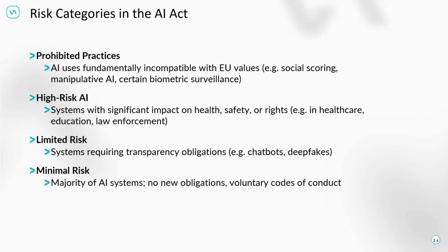That's what the AI shall do. It shall not be just a chatbot to communicate with elderly patients to make them feel better. It shall give them more knowledge, and that is then a relevant decision you need to make with the high-risk product. So most likely it is a high-risk product if you use AI for medical.